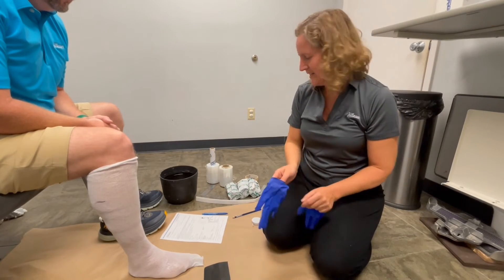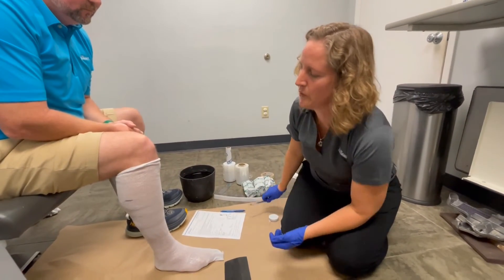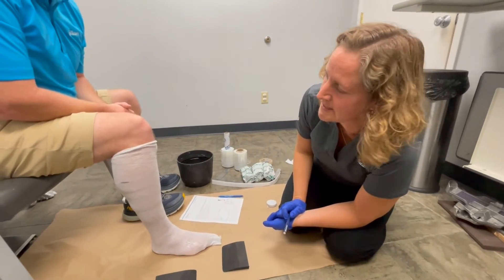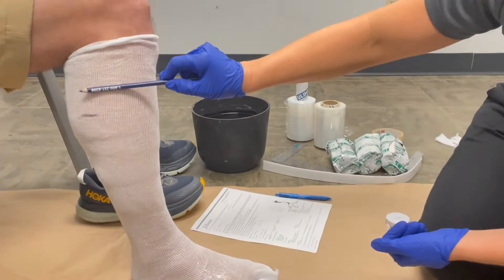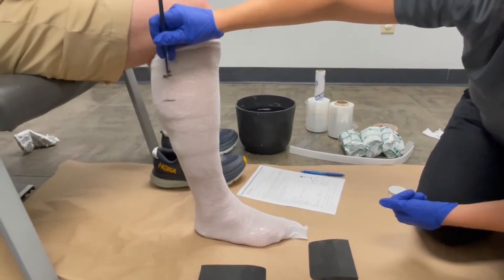I'll use gloves so I won't get too dirty. When casting, I want the cast to be about two inches higher than I want the orthosis to be, so I'll go from here up to here to make sure I have enough space. This is really important — getting a cast right takes five minutes; for us to fix it takes an hour and we have to charge for that. So get your cast right, whether it's us or your technician, because it saves money in the long run.